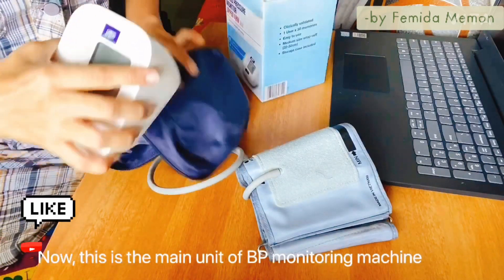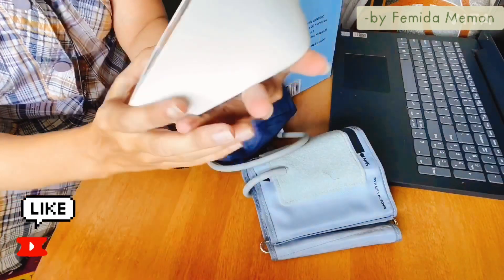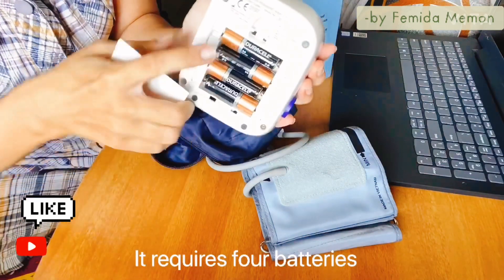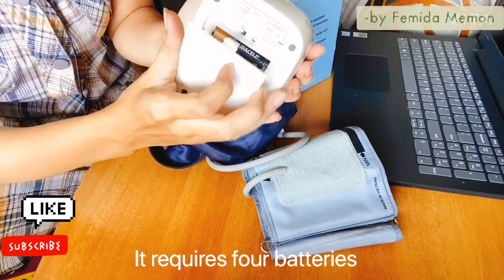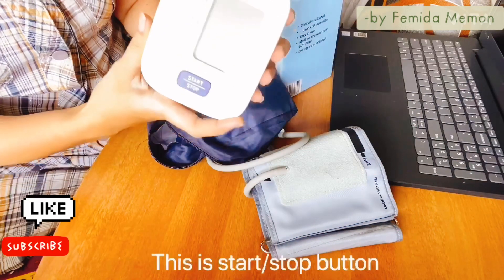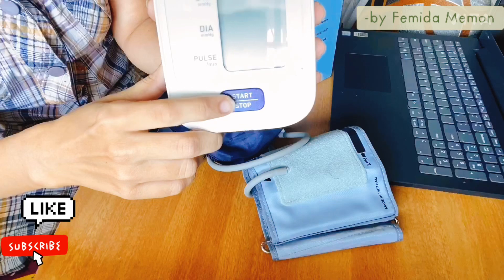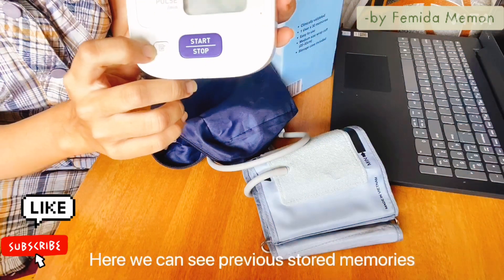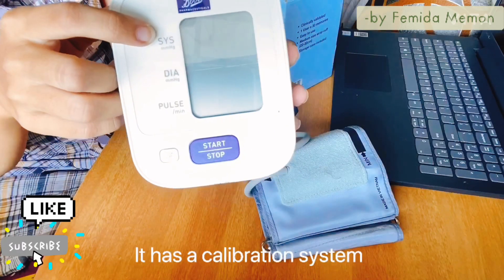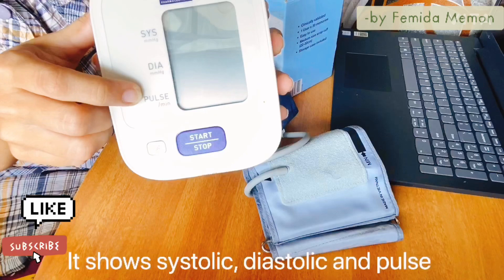This is the main unit of the BP monitoring machine. It requires four batteries — I have already inserted four batteries in it. This is the start or stop button, the blue one — it is also called the power button. And this is the button where you can see previously stored memories. On this display you can see it has a calibration system. It shows systolic, diastolic blood pressure and pulse rate.